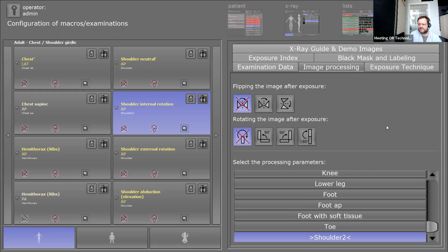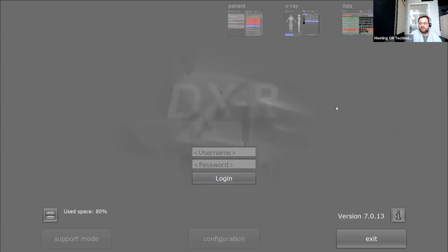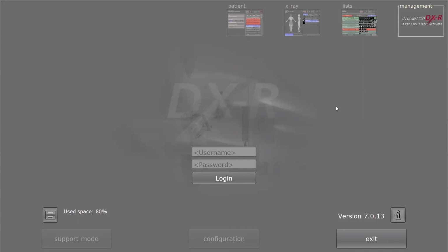Is it okay to understand? Okay, understand. Yeah. So yeah, you can try it yourself or just send us an image with a small description how you want to have it instead. So adjustments, and we will send you a new processing file, and we can also guide you to import it and to set it up. So that's no problem. Okay. Anything else?